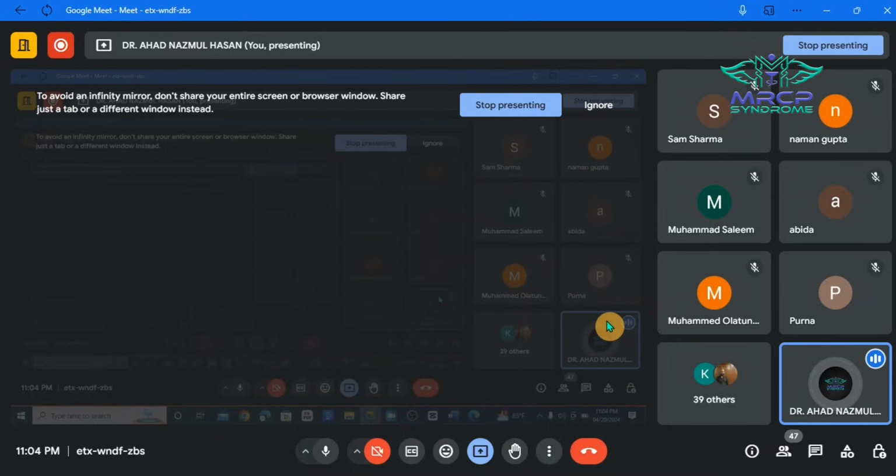Also in case of MRI, usually we go with the gadolinium contrast. And in case of CT scan with contrast, usually we go with the iodinated contrast. This iodinated contrast with CT scan is usually more suitable for the detection of three conditions: tumor, infection, and inflammation. So can anyone tell me the neurological indication of cranial CT?